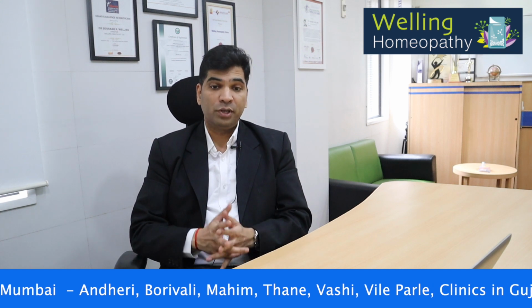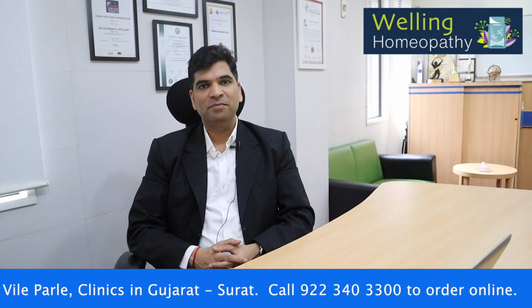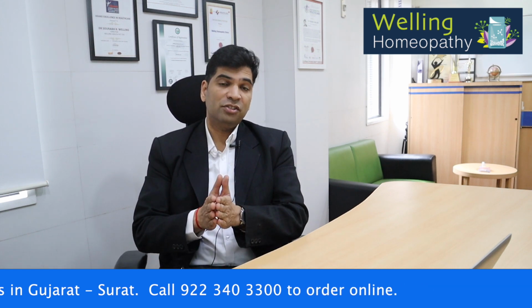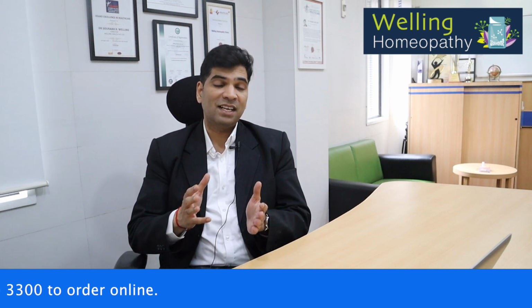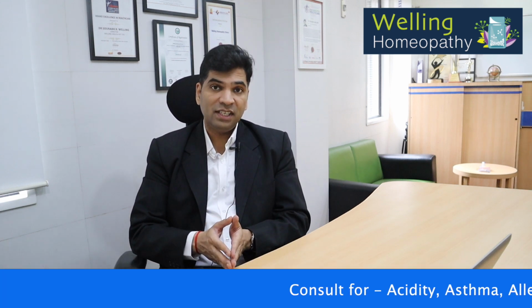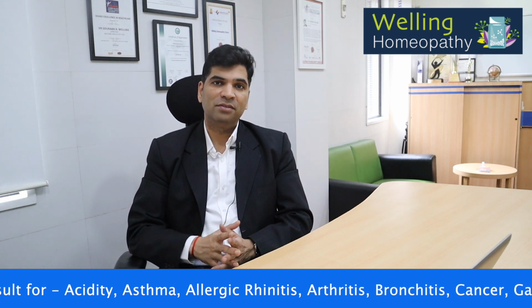Now, there are a variety of ovulation predictor kits available. You can order them online or buy an ovulation kit from a medical store near you. Be sure to read the instructions of that particular ovulation kit, since there might be slight variation in how they work. Generally, however, an ovulation kit comes with a set of 5 or more test strips.